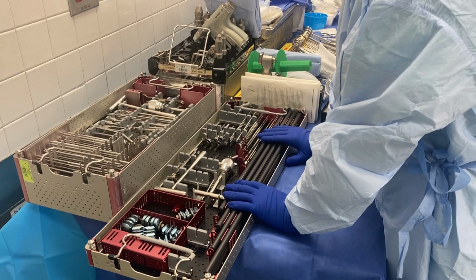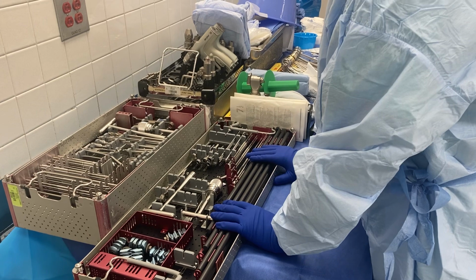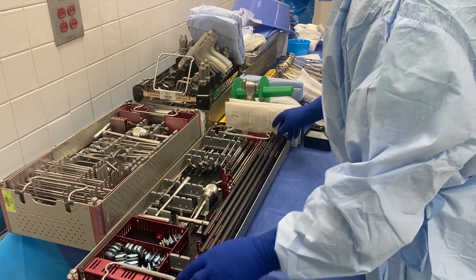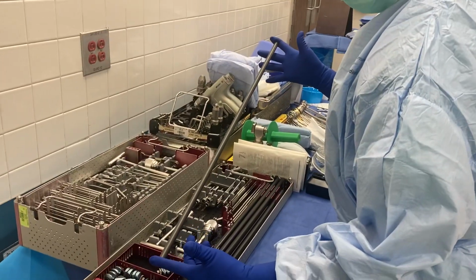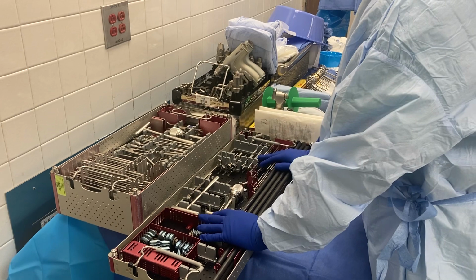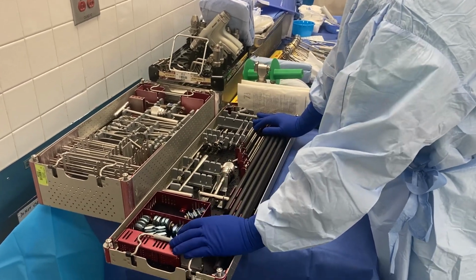So we would need longer bars in order to cross the knee and make it a really long X-Fix. Basically from the femur to the distal tibia is the X-Fix that we're going to put on today. These are the longest bars that we have. If it's not long enough, that's okay, because we can put bars together to make it even longer. So I'm just going to run through these trays really quick and give you an overview and an idea of how we're going to be putting the X-Fix on.